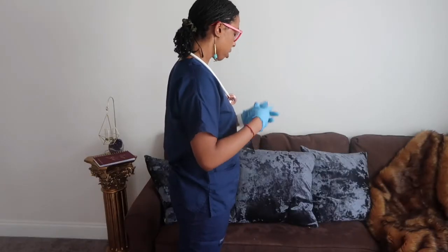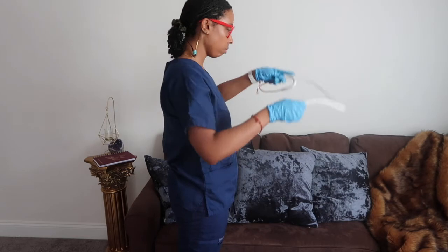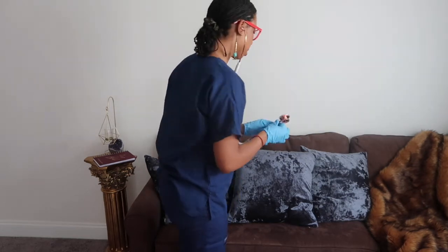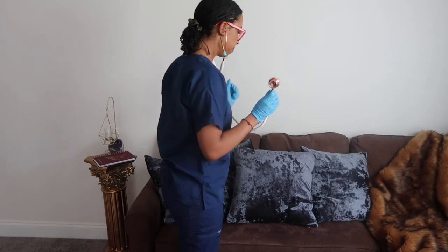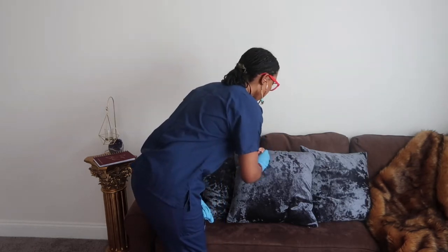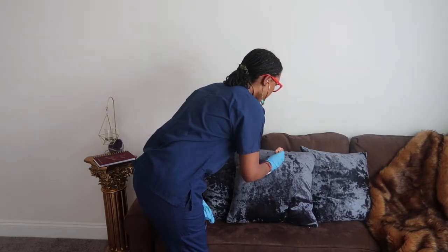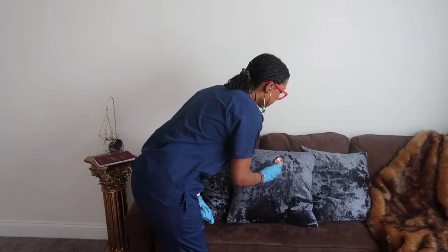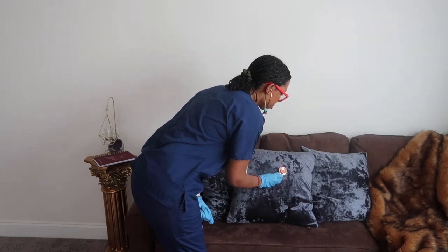I'll be listening to your heart. First I'm going to listen with the diaphragm. I'm going to start on the aortic valve, then the pulmonic valve, Erb's point.